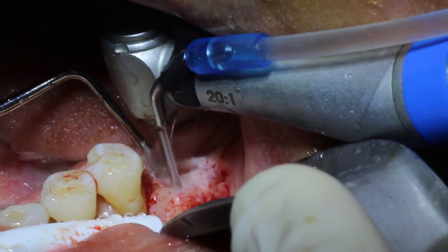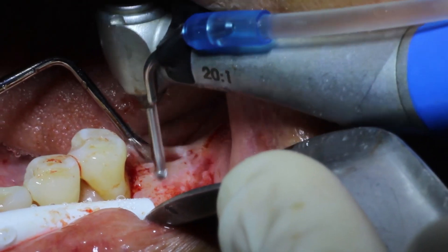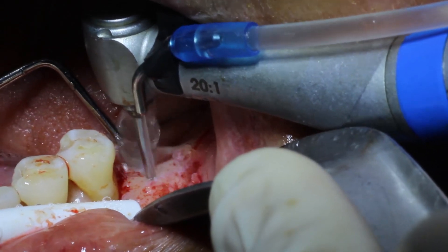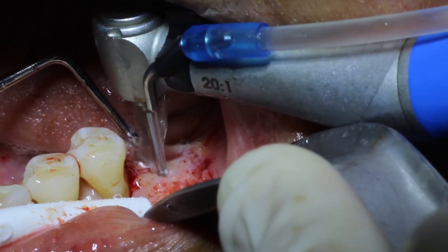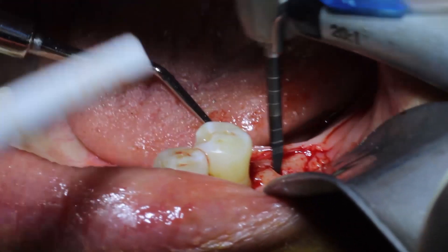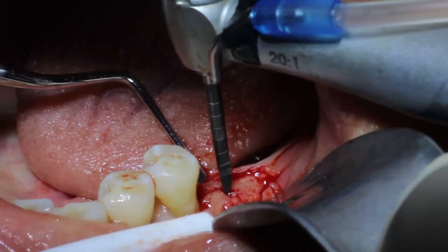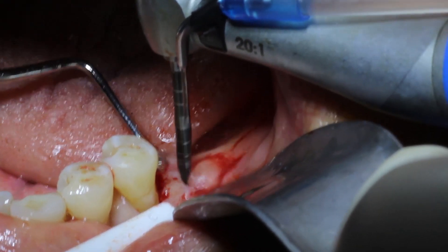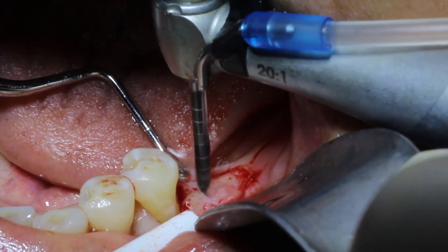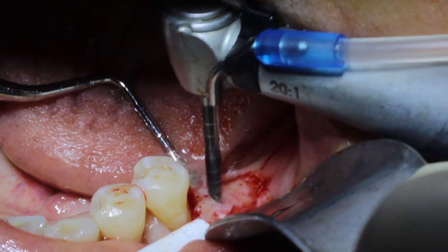That's about as much as I want to drill with this round burr, so now I'm going to jump up to my regular pilot drill. This is a pilot drill from Neodent — I particularly like this drill because it's really long and sharp and it's got markings along the entire drill. I take it to the middle of where I made that marking with my round burr and take it to about six millimeters of depth.